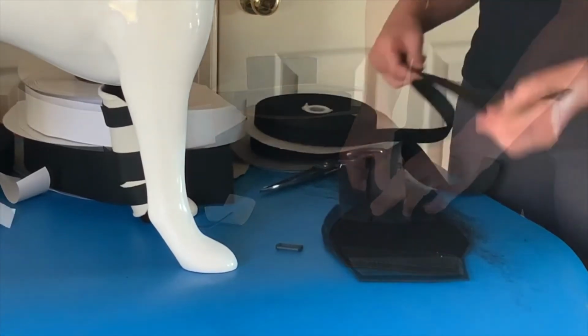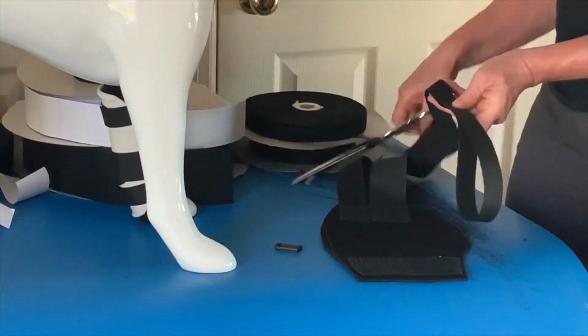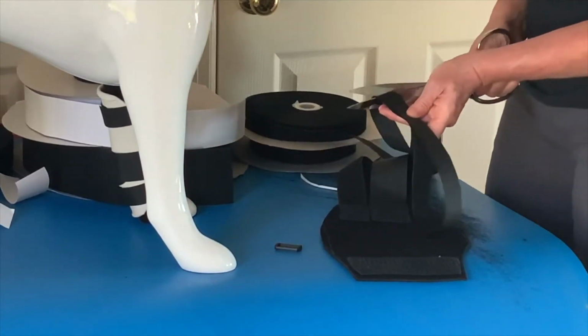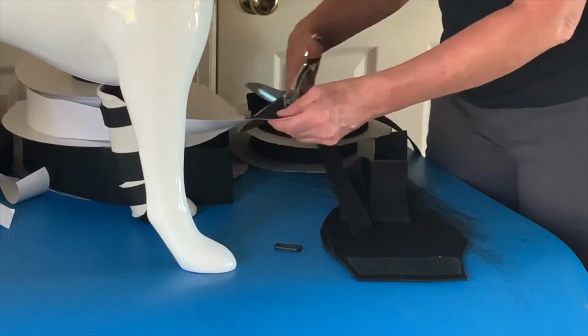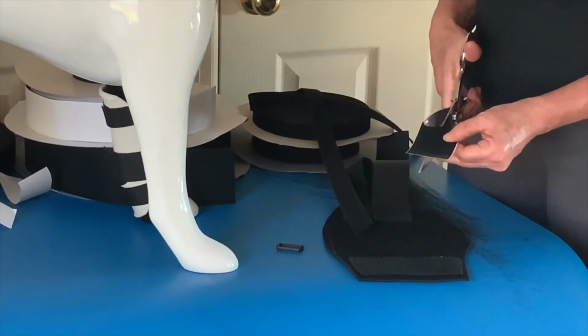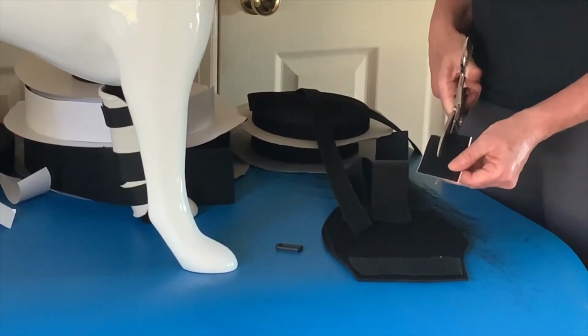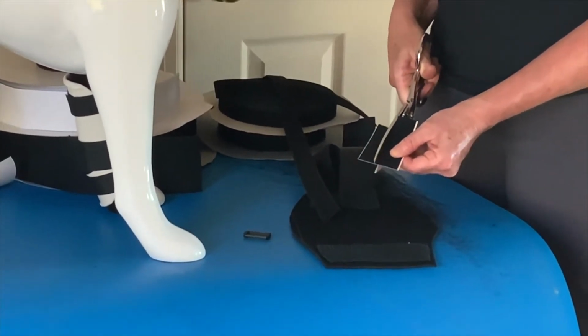Finally, I think I'm going to use a D-ring for the most distal strap. Distal D-rings allow you to better cinch and anchor the brace in place. For this example, I'm using a 1-inch wide distal strap. Make sure your nylon strap is long enough to wrap twice around the brace. Then cut an extra long piece of self-adhesive hook.